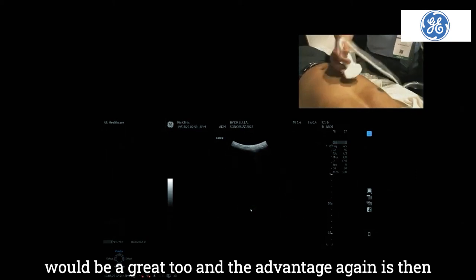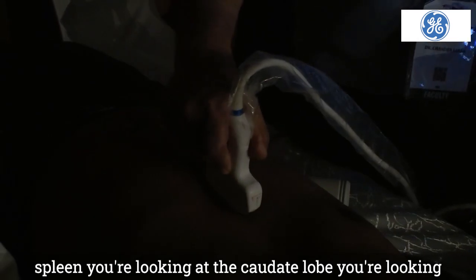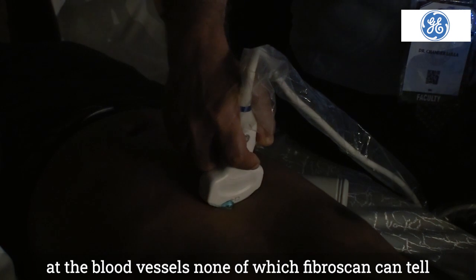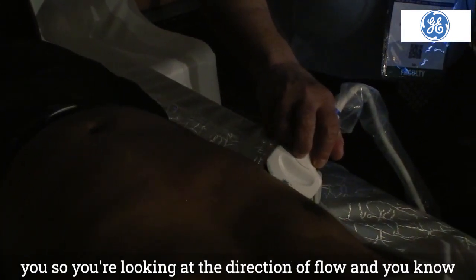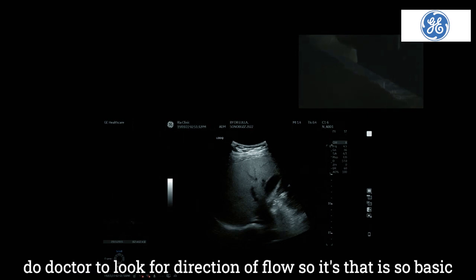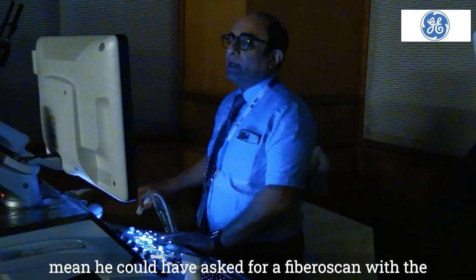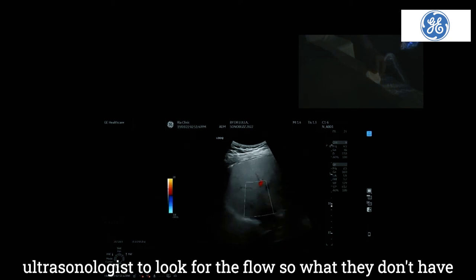And the advantage again is then you're actually looking at the liver, you're looking at the spleen, you're looking at the caudate lobe, you're looking at the blood vessels, none of which Fibroscan can tell you. So you're looking at the direction of flow, and it is damn funny. I had a patient yesterday with Fibroscan done with the hepatologist, and then it was sent to me, please do Doppler to look for direction of flow. So it's so basic that, I mean, they could have asked for a Fibroscan with the ultrasonologist to look for the flow.